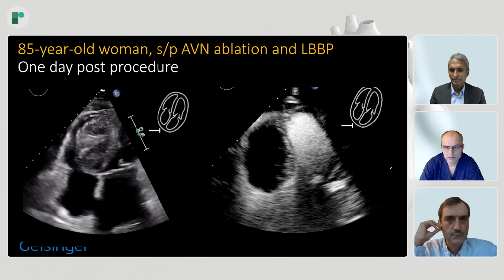Oscar? Well, go ahead, Marek. Yeah, septal hematoma, in my experience, is a really rare complication. I always check my patients with a transthoracic echocardiography before and immediately after the procedure.